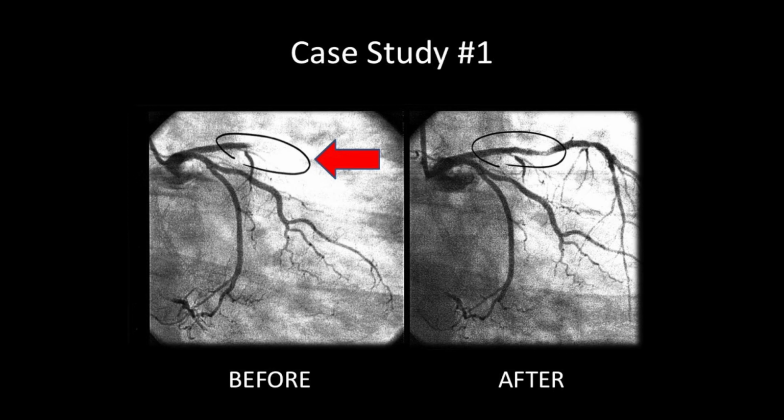And the problem is this is a still shot, so it's not as easy to see because the heart is obviously moving, in her case 112 times. Hopefully by then it's slower. But so you have this thing doing this, and so they take still images too, besides the movie run. And then they go in, and they have this catheter, it's all part of it, and there's a balloon that they blow up. And they blow it up with an insane amount of pressure. Is it 3 times tire pressure or something crazy, right? Crazy amount of pressure. They blow up this balloon and it pushes all that crap against the wall.